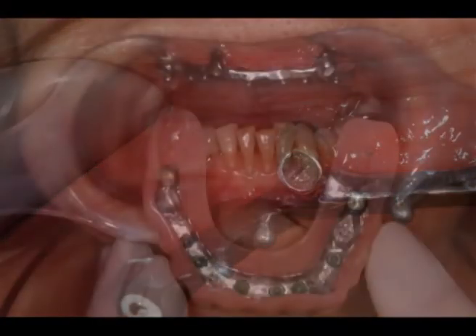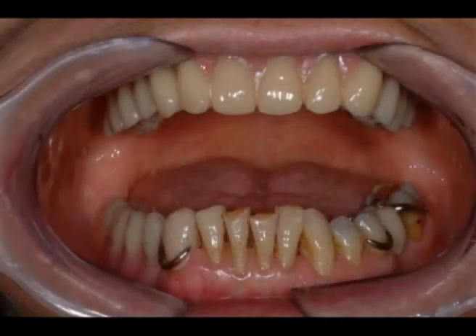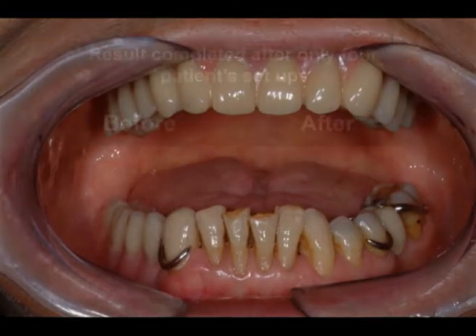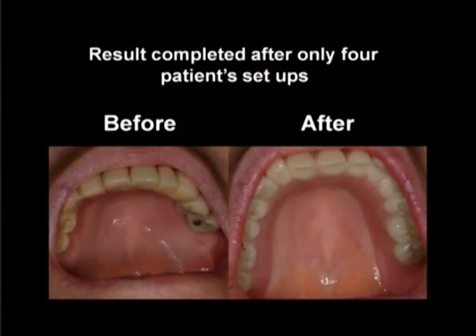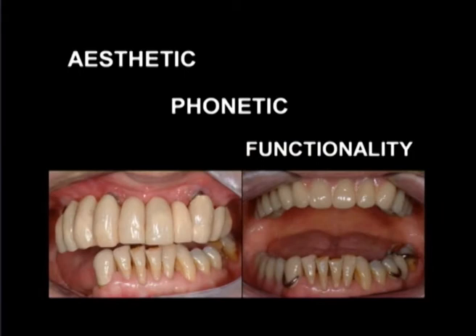Main bar passively cemented. Removable denture with incorporated cast overstructure. 6 elastic retentive caps. At the first checkup visit, retention will be monitored. It can be either left as it is if the retentive strength is valid, or the caps can be replaced with some more retentive caps. The annular blocks technique gives optimal aesthetics and stability using minimum space, like a fixed prosthetic solution.